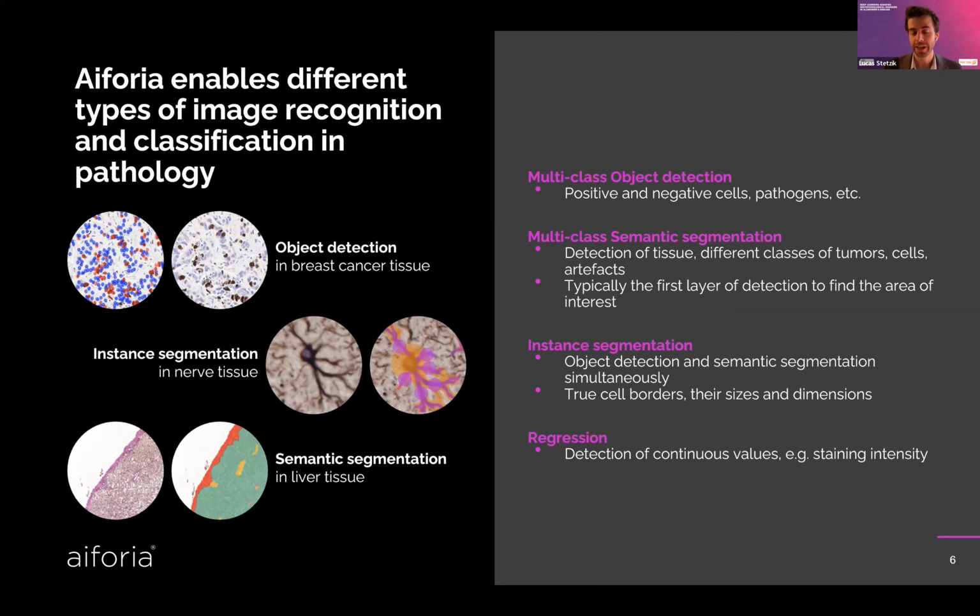And then additionally, if you have some more complex features related to those cells, say you want to quantify the activation state of glial cells or just any change in cellular morphology, the limitation within our platform is really the resolution of the images. You can add an object detection layer that will make it so you can quantify each cell, and add instance segmentation to that object detection layer.